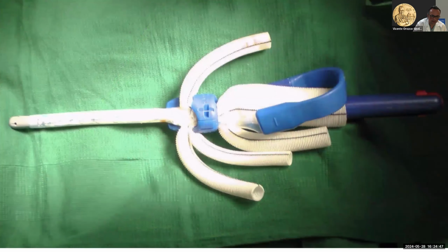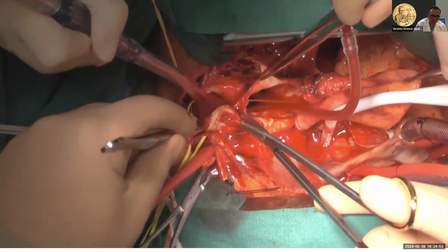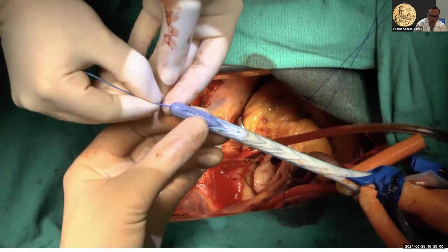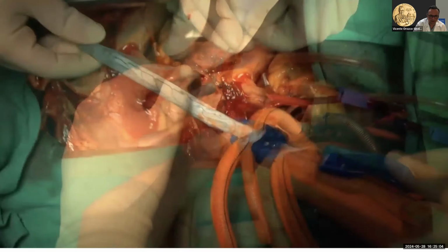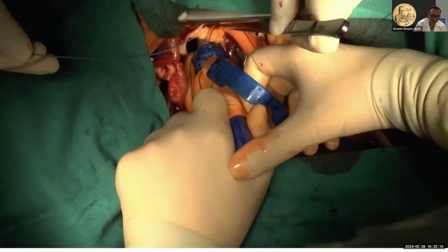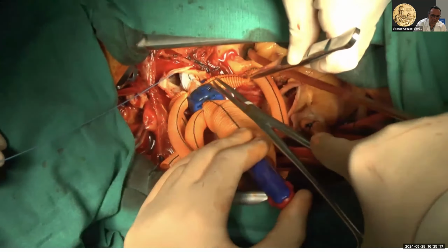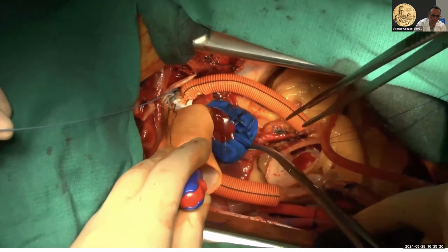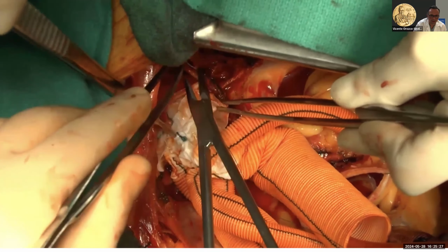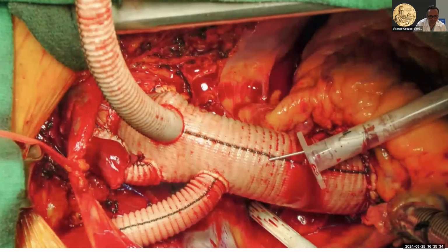So this is a video of how the device is used, for those who have been in the OR with us. This is what we do. We transect the arch. At this point, we are perfusing with our cannulas, doing antegrade perfusion to the carotid and via the innominate artery. And we advance a wire, and we advance the tubular portion of the graft. We unsheath the device, release it, take the wire out. And they have a collar that is going to be sewn into the distal arch. It's the completion.